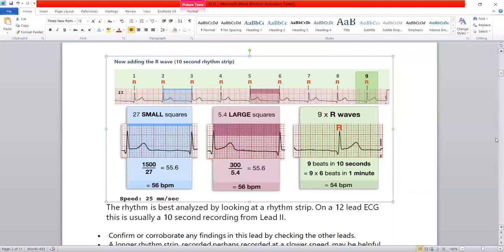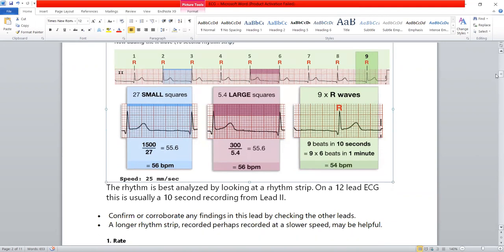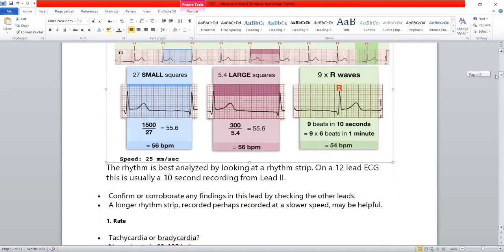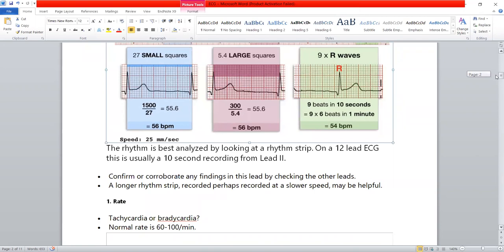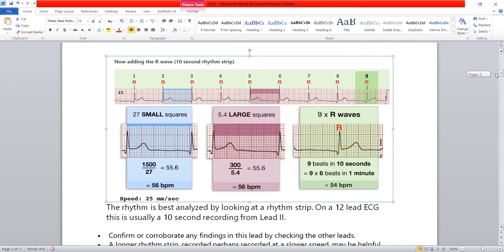The second step after calculating heart rate is to assess the rhythm. We look at the ECG to see if the RR intervals are regular. If the number of small boxes between all RR intervals is the same, the rhythm is regular. If the RR interval varies, the rhythm is irregular. Both rate and rhythm are assessed from the rhythm strip at the bottom of the ECG, which is lead number 2 and is 10 seconds long.